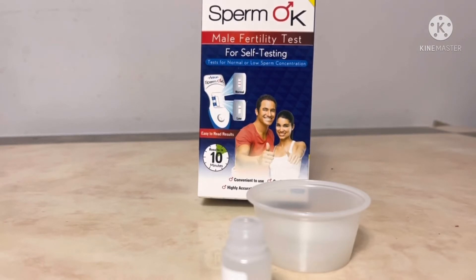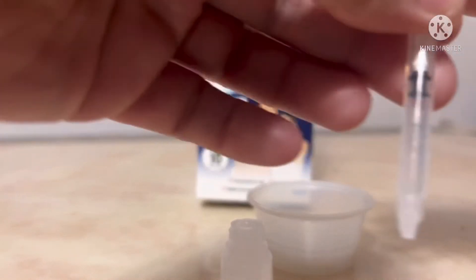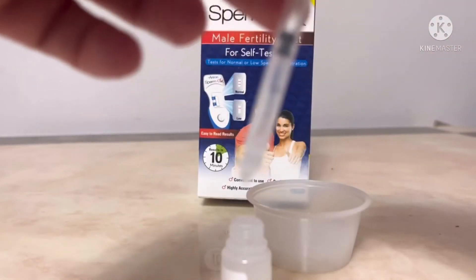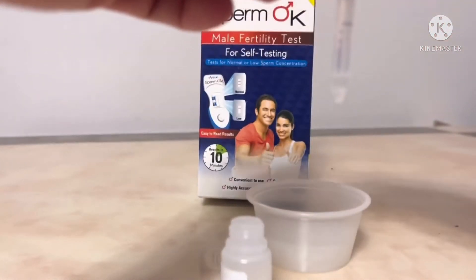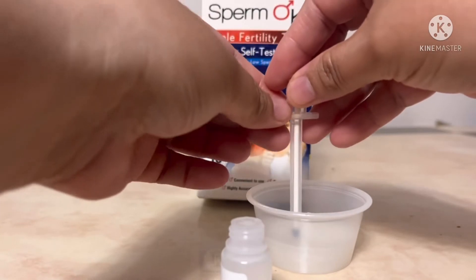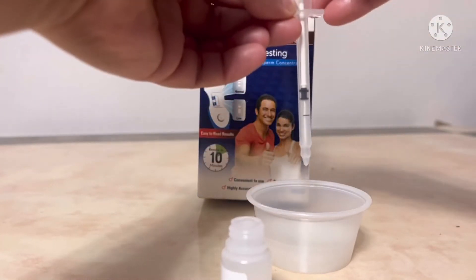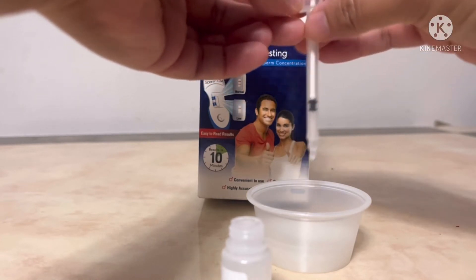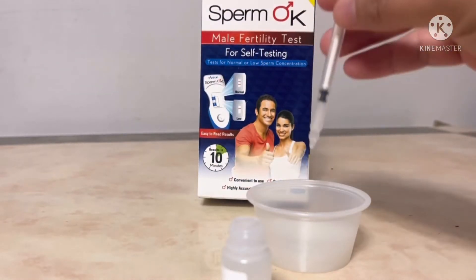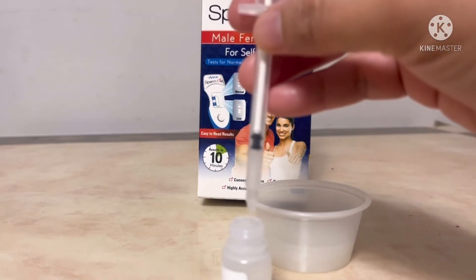After 20 minutes, this is the mark — we should get to the black line. This one is the black line. Then we put it in this solution.